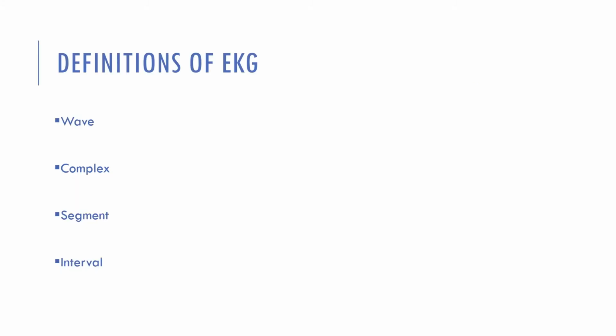Next, let's talk about some definitions that you're going to hear when we start talking about EKGs. First, you're going to have a wave. This is a deflection away from the baseline. That wave is a deflection away from the baseline.